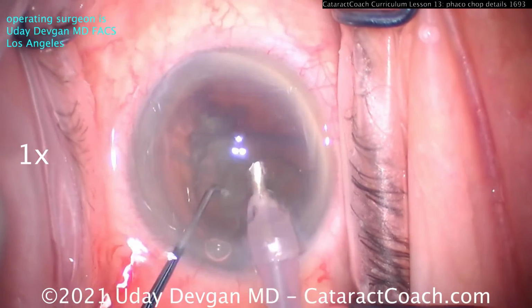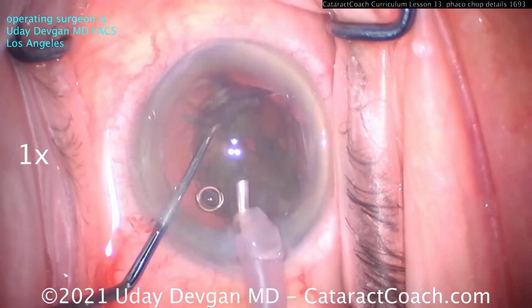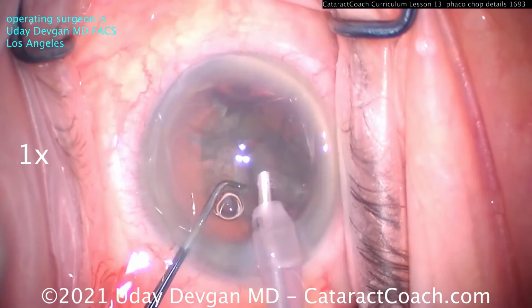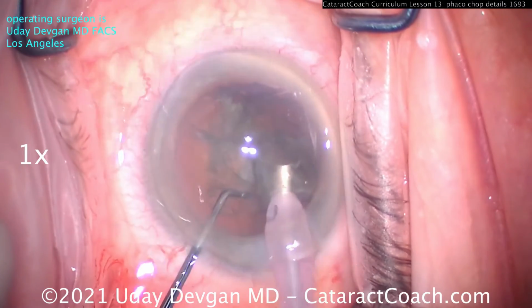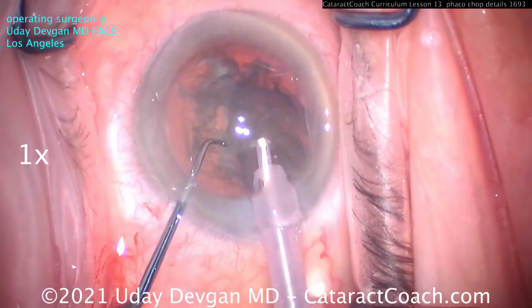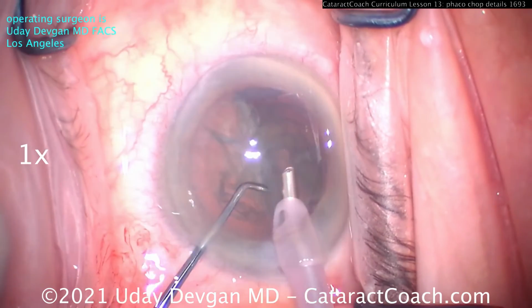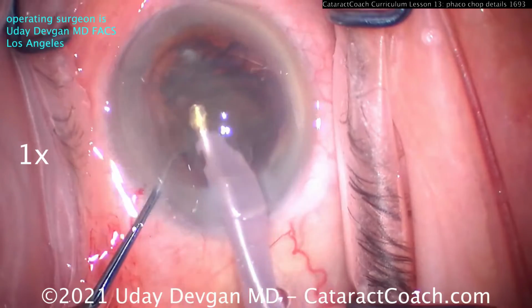So you see, the eye kind of stays in primary position. Those three light reflexes, the Purkinje images on the cornea, they stay basically in the center, and that's important. We're pivoting our hands and our instruments within those incisions to keep the eye in primary. And we take out one half of the nucleus first, and then we can remove the other half as well.